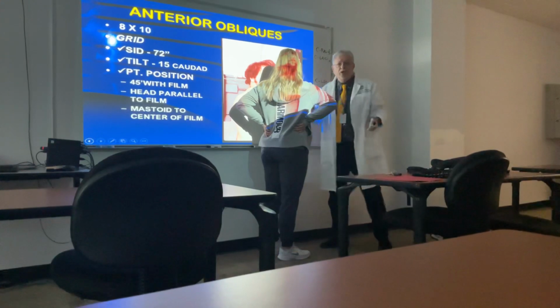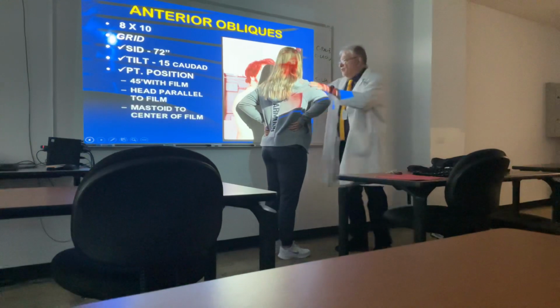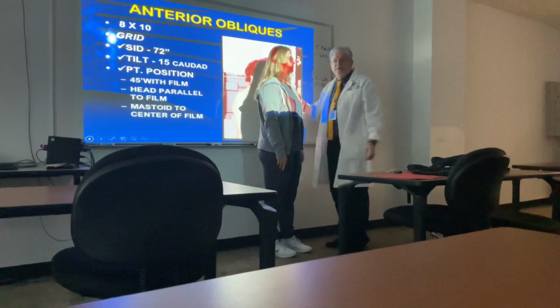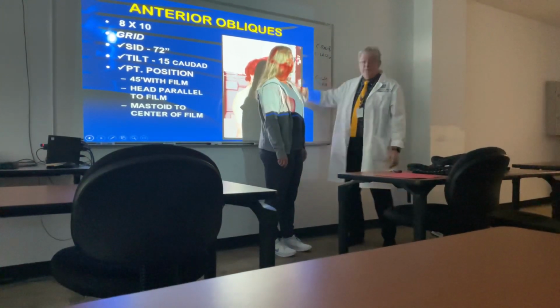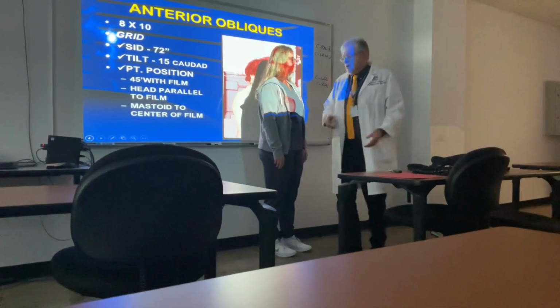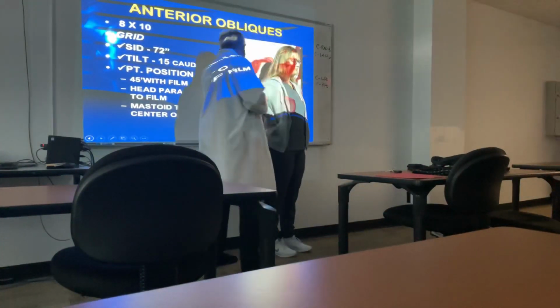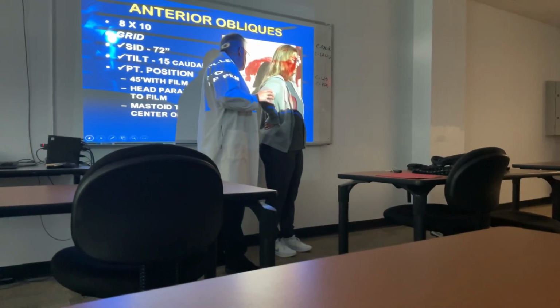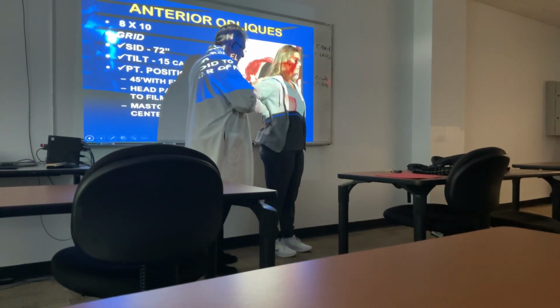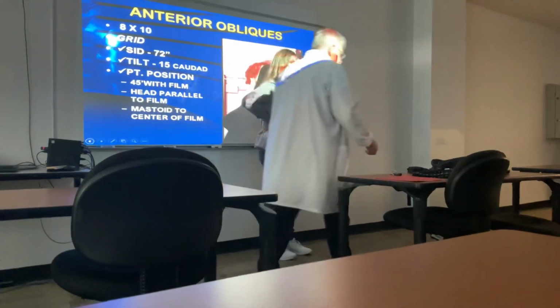Some people will argue, well, I want the spine closest to the capturing device. So we can do a posterior oblique view. If I stand you this way, just relax your arms. Which shoulder is closest to the film? The left. That's the marker. We always mark the side that's down. Now put your hands the same way we had before, and I'm just going to exaggerate. So I'm going to turn you ever so slightly. Just bring this arm back a little bit. Good. On a left posterior oblique view, if you bring this back, which IVF is clearest to you? The right.